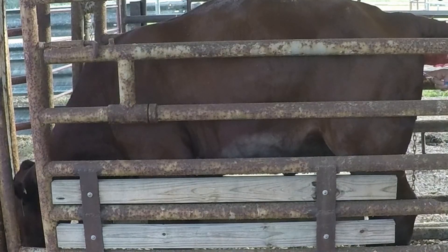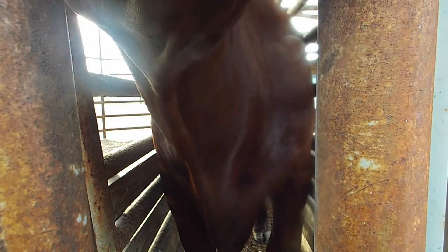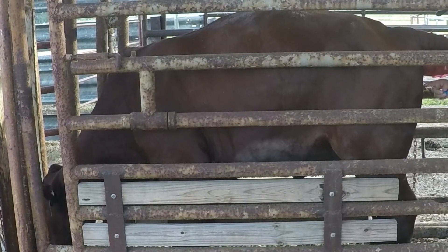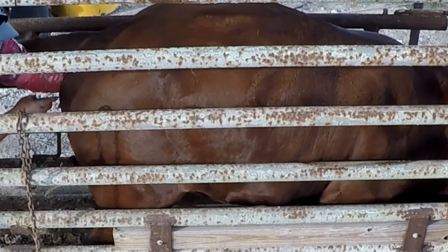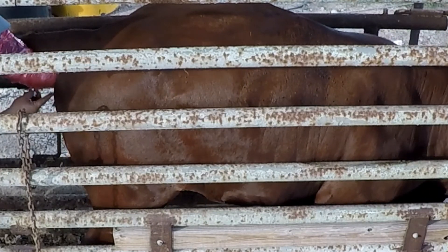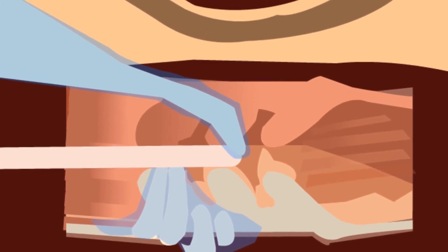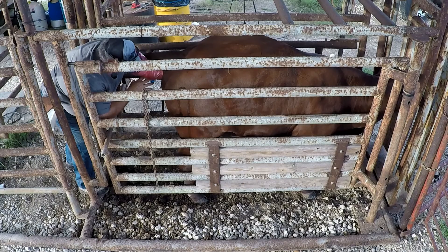I'm going to push it forward just a little bit. Straighten out the vaginal track. Now I'm looking for the entrance to the cervix. Use my thumb to guide the gun into it. Now I'm into the cervix. Moving through — it's just a little bit twisted. I'm manipulating the cervix with my left hand, through the cervix into the body. Releasing the semen, and done.